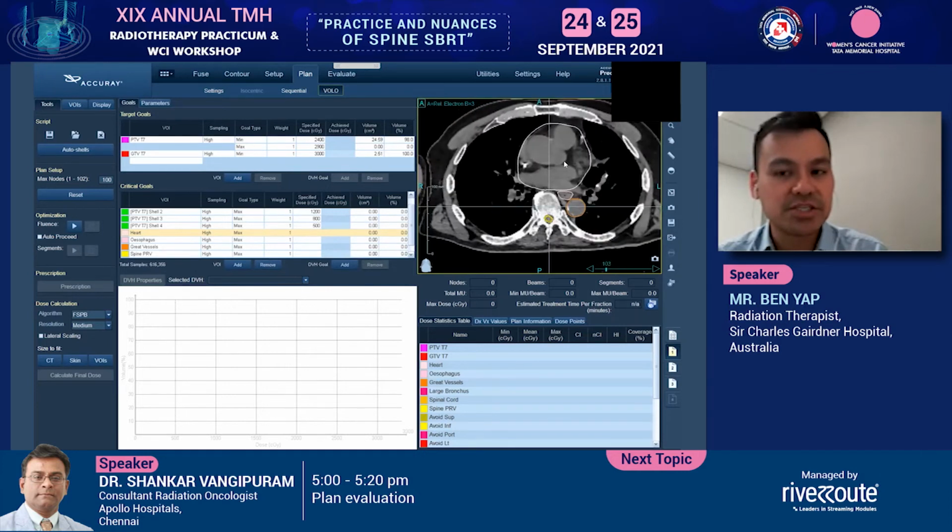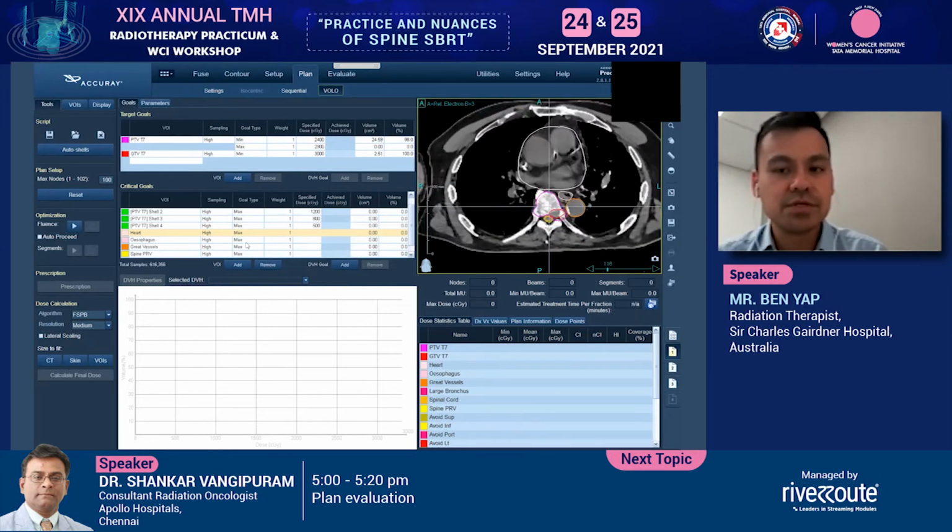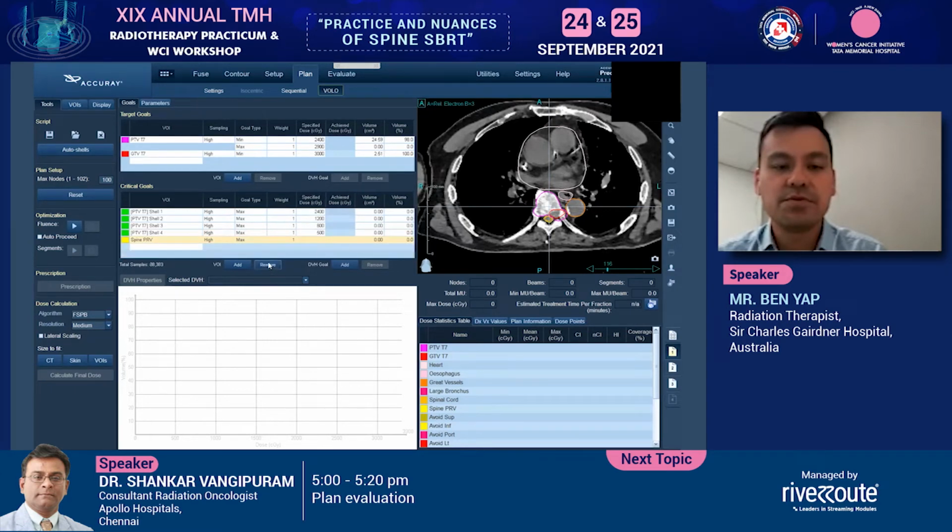So here is my suggestion. Here's my tip for you. Don't do that. Just remember that number, 600,000. Instead, what I would recommend you do is create a structure that only takes a part of the heart that is closest to the target or the PTV. So let's see how I do that. I remove the contour.